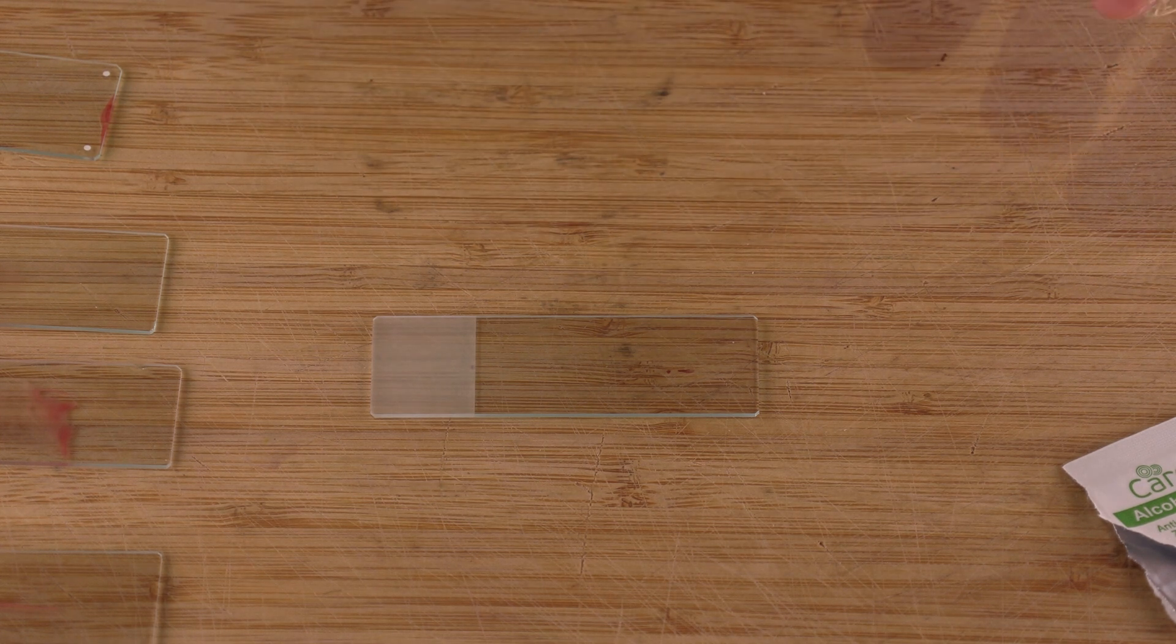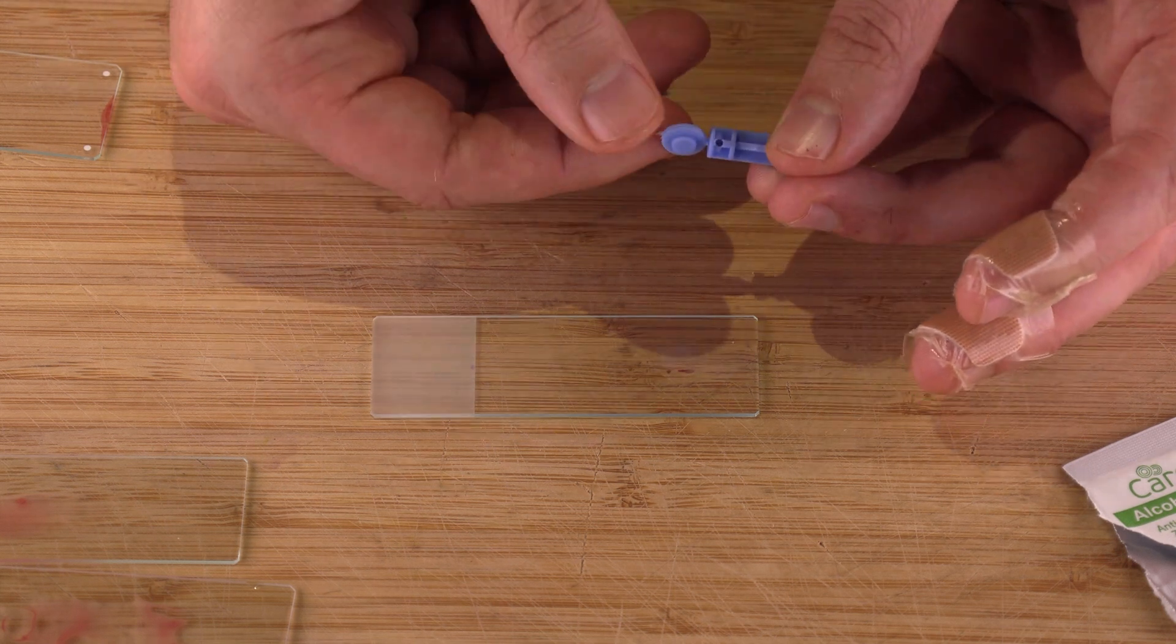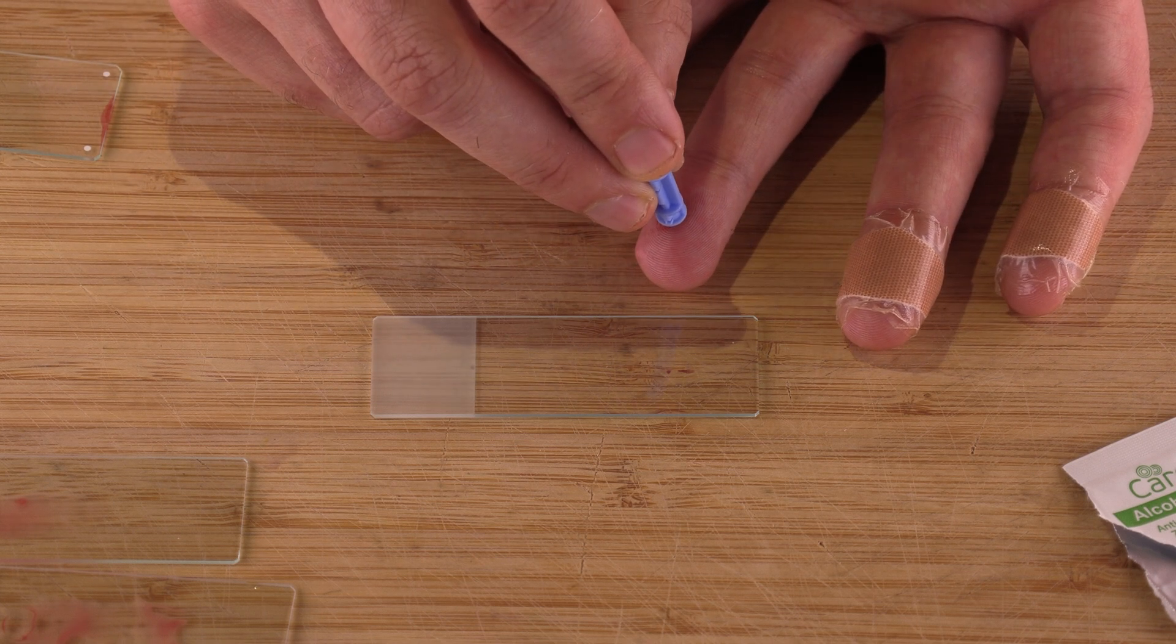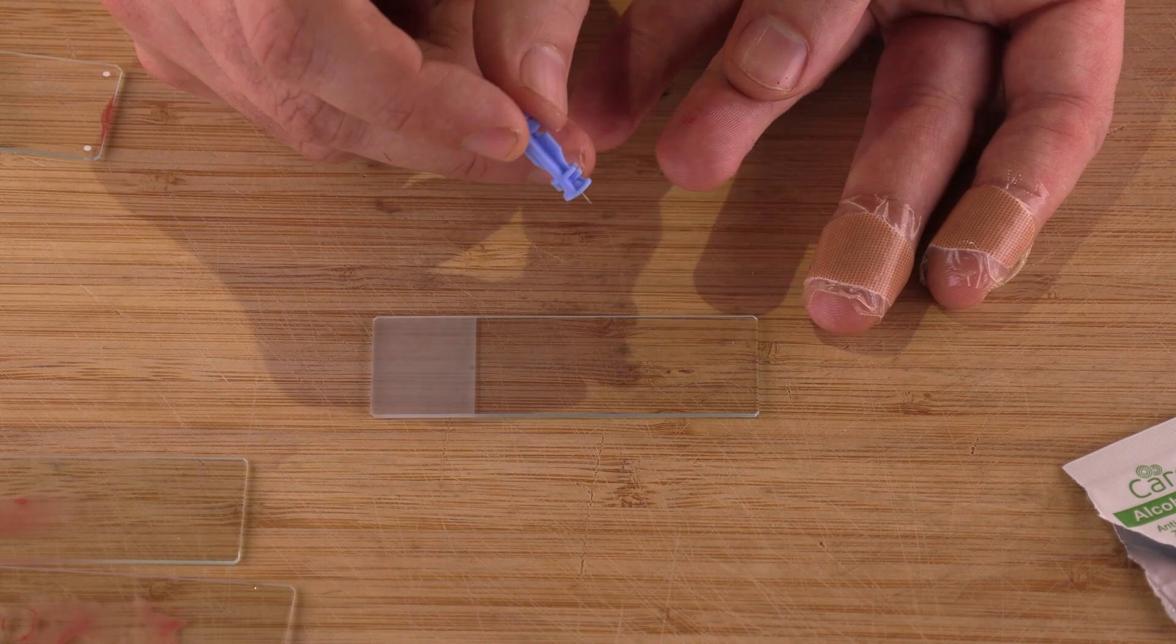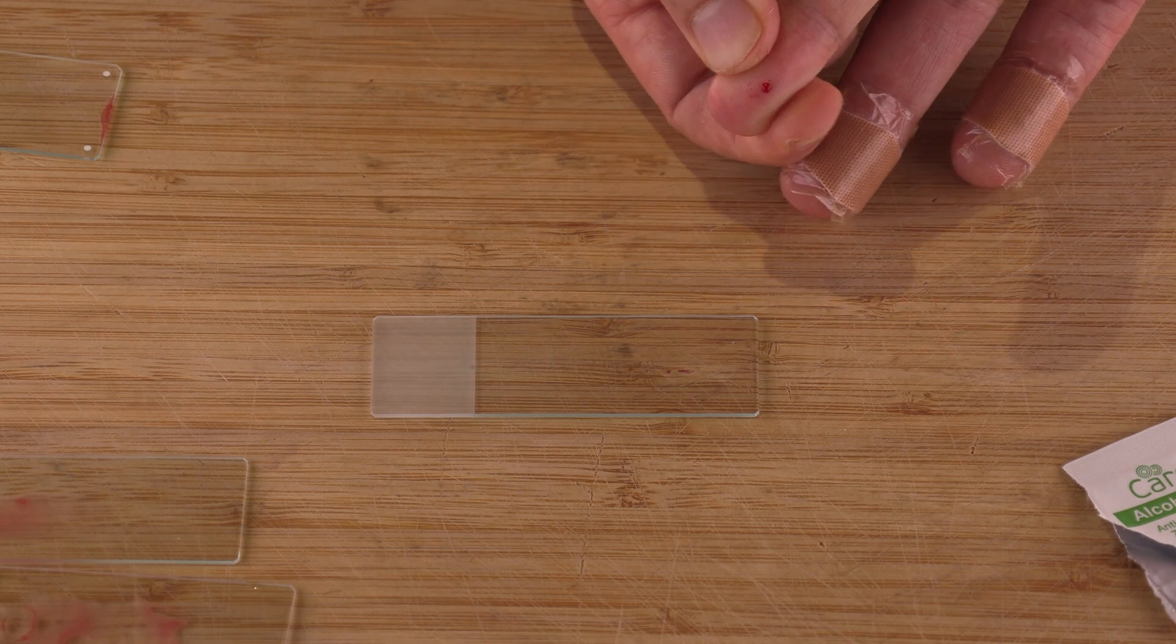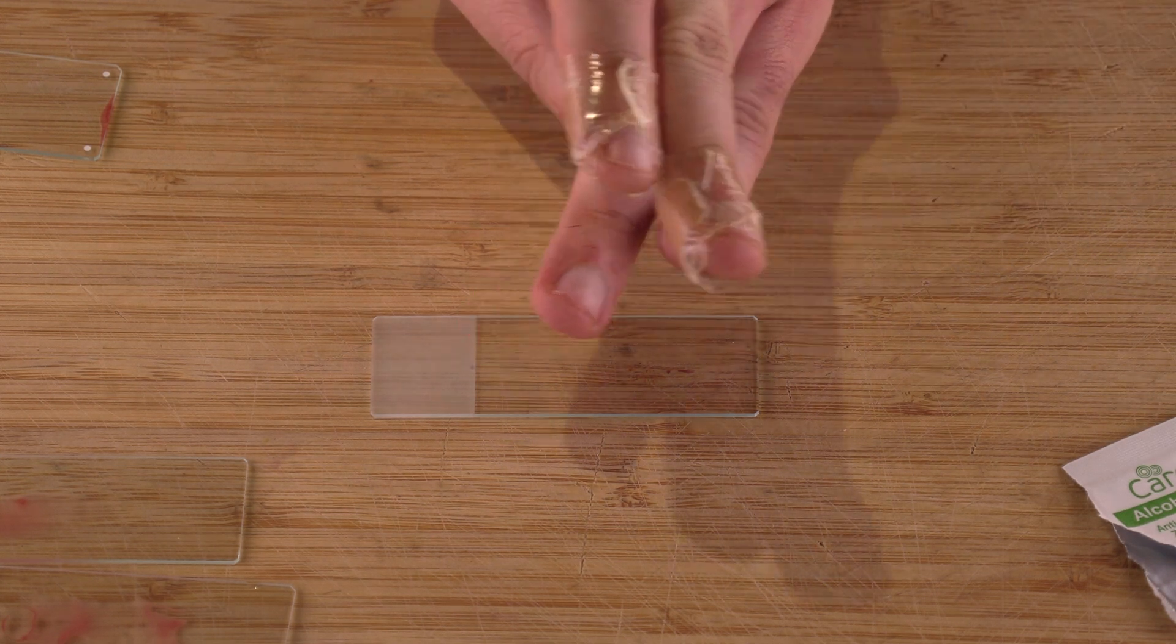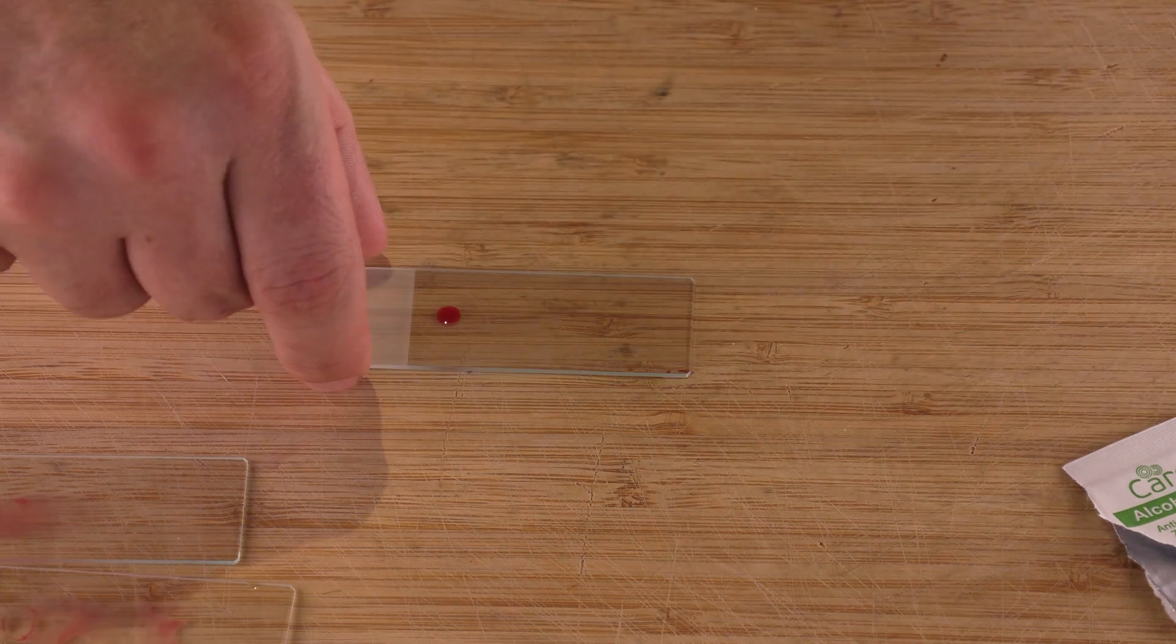Now I'm going to grab a blue lancet. Alright so I grabbed the blue lancet. I'm getting a slightly deeper prick, a little deeper wound so I'm going to get a little bit better blood flow. Alright little prick here. Now I'm going to squeeze it a little bit, a real gentle squeeze. I'm not forcing anything, I'm taking my time. Oh there we go and this one is coming out. You can see that it's coming out much more drop like and I'm not having like the flat kind of blood situation. So already there I'm really happy that was really quick. So I go near the frosted part as I hold up the slide to it.